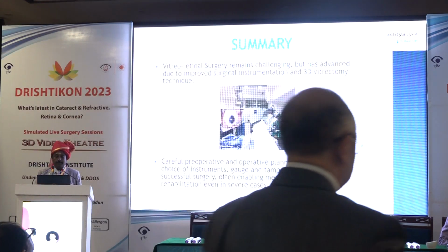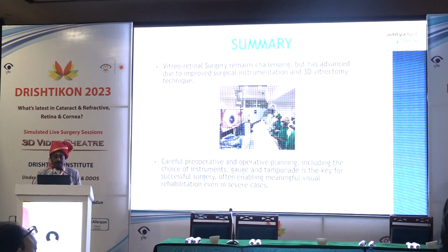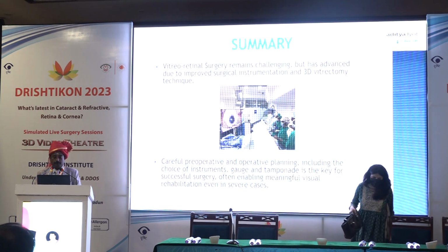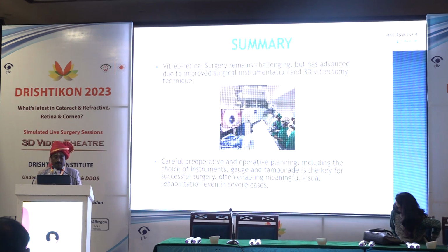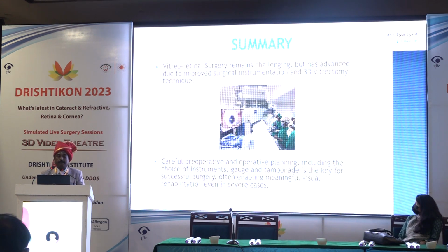This case was given up, and I actually took an informed consent of neovascular glaucoma producing a blind, painful eye, but fortunately with the anti-VEGF, laser, and also removing all the membranes, I think, touch wood, I have not seen any neovascular glaucoma.